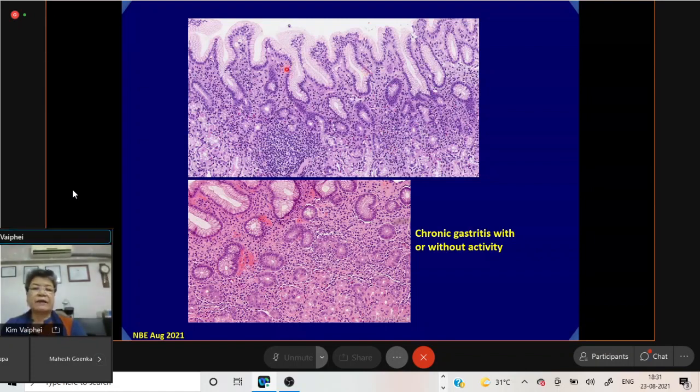And these are very frequently seen in our setting. It is because of infective association, or infection related. That would be H. pylori. H. pylori infection is most frequently seen involving the pyloric antrum. Involvement of the pyloric antrum is because of its strategic position, not otherwise. The remaining part of the stomach can also be similarly involved by H. pylori infection.